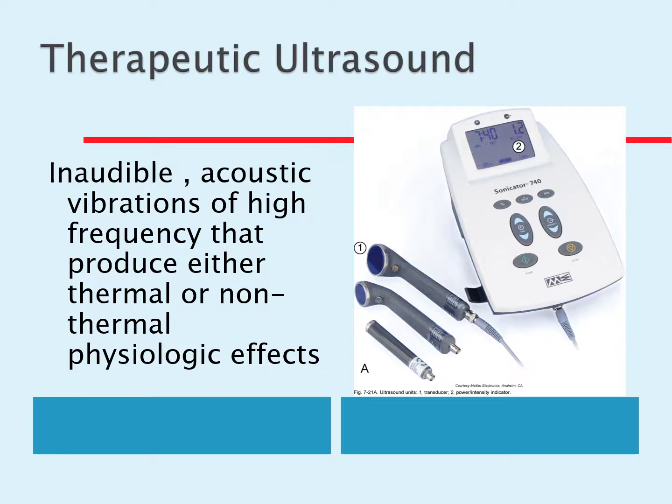Therapeutic ultrasound is an inaudible acoustic vibration of high frequency that produces either thermal or non-thermal physiological effects. It operates via the function of conversion, meaning it will convert sound waves into some other physiological effect that will help improve the overall healing of a patient.